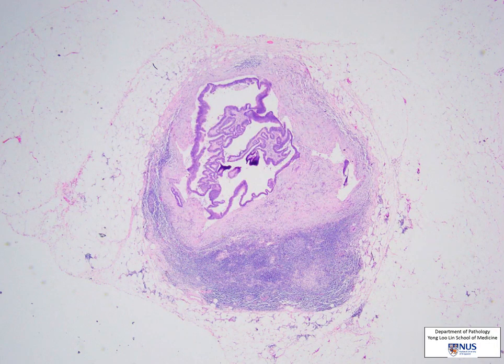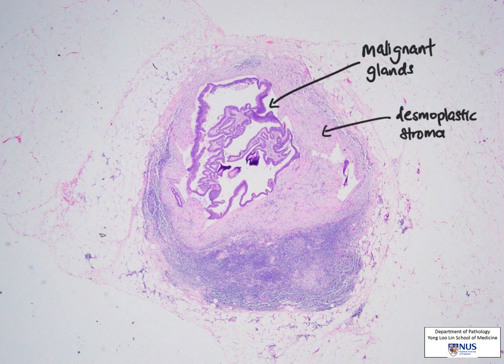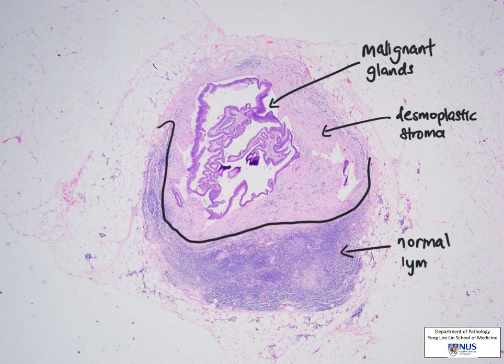We will now move on to the lymph node that was cut in cross-section. There are obvious glandular structures that are not native to the normal lymph node, and these are metastases, surrounded by desmoplastic stroma. Adjacent to the tumour is the normal lymph node architecture, filled with lymphocytes. After sampling all lymph nodes in the pericolic fat, this appears to be the only lymph node involved with tumour, and will be staged as N1.